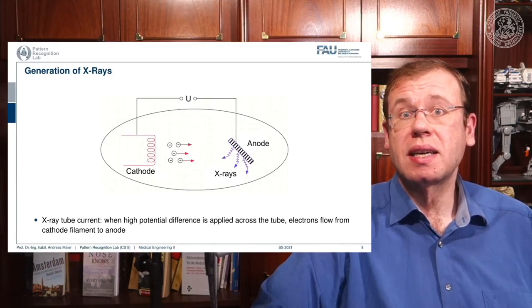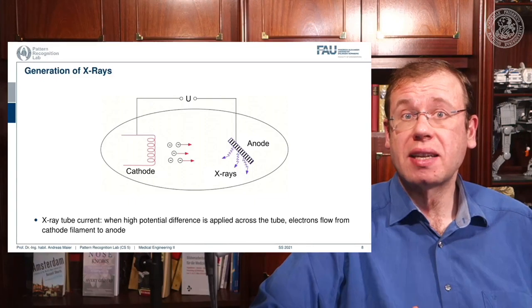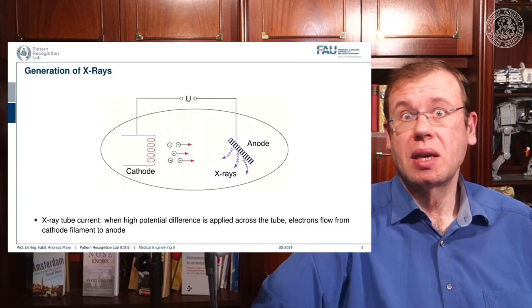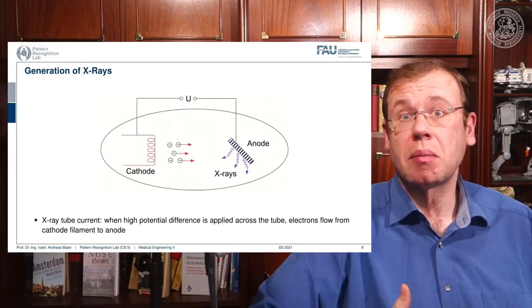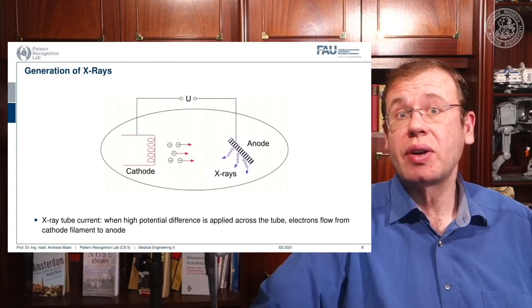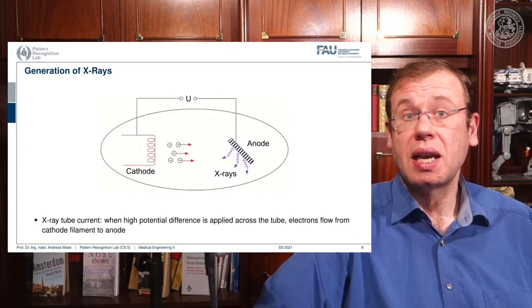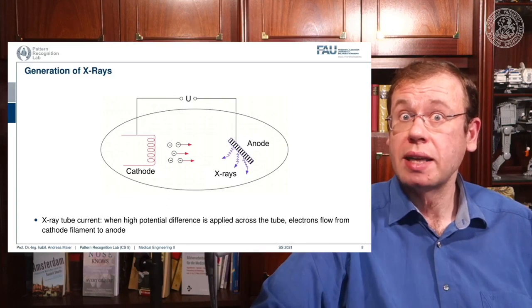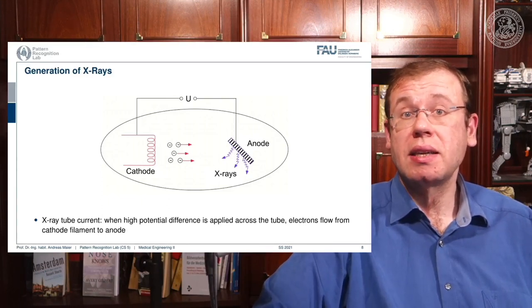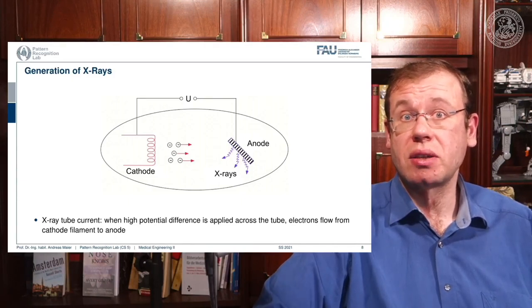What happened is that Röntgen discovered that although he can't see any of the light, there is some effect happening on this photo plate. This is essentially a kind of chemical compound that reacts if some light is coming in and it darkens. This is a very early technique of photography, actually. Röntgen had these photo plates and was trying to generate light with higher energies. Although he shielded the light away using cardboard, he could still find that his photo plate was darkened, so some kind of radiation arrived there.